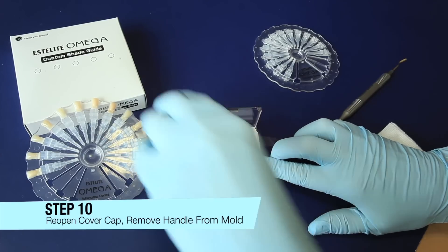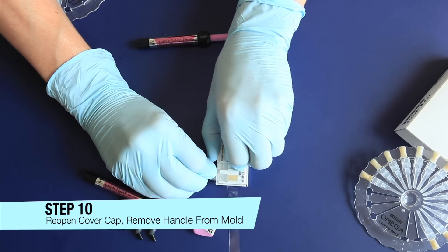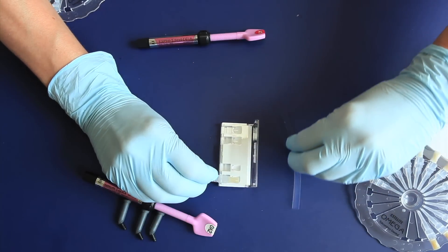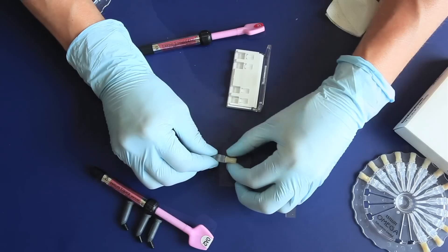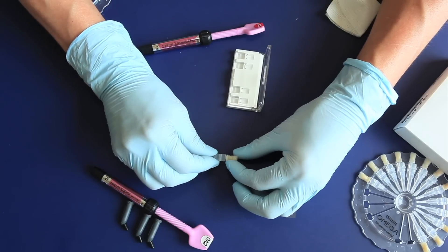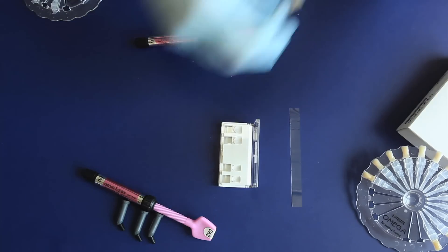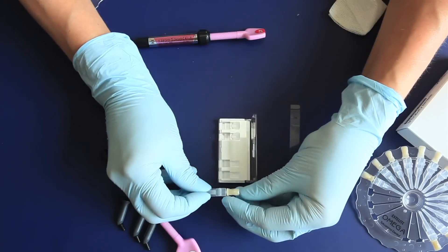Step 10: Reopen the cover cap and remove the handle from the mold. When opening the cover cap, gently push the handle down. Remove flash as needed. Please note that polished dust and fingerprints can change the glossiness of the composite resin, so do not over-polish the edges and avoid touching the composite.